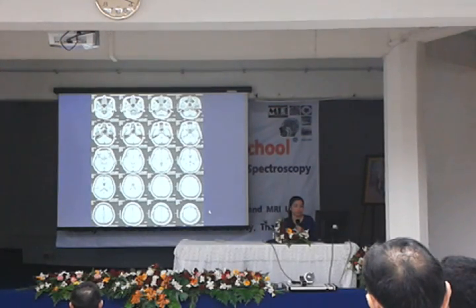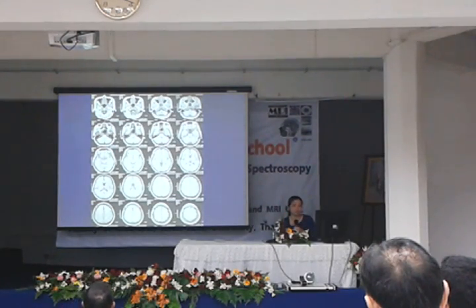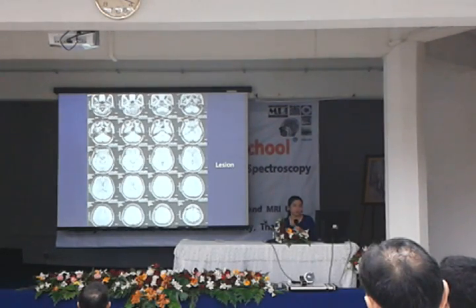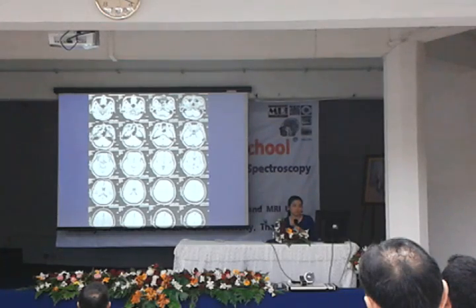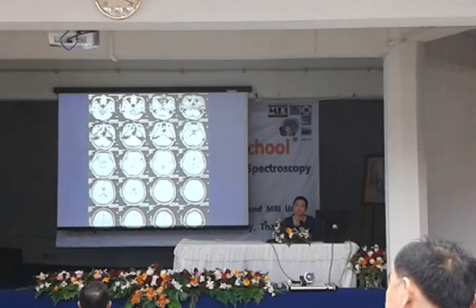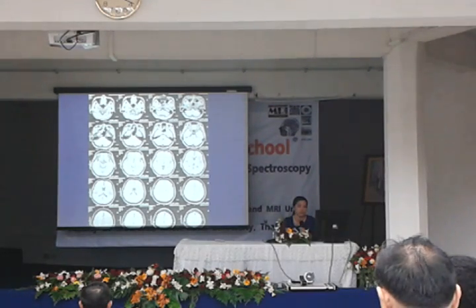May I briefly explain how radiologists make the diagnosis of disease in the patient. We look at a ton of images in T1, T2, FLAIR, and post-contrast imaging, try to find the abnormal findings in these images, add to that the clinical information from the request form, and try to make a diagnosis of the disease in that patient.